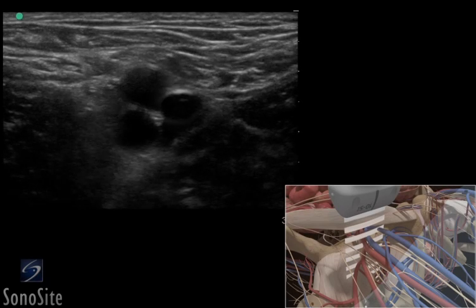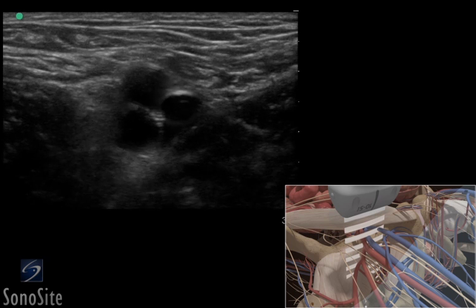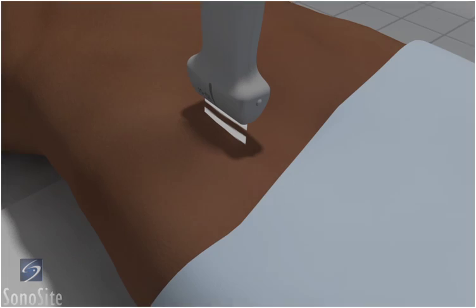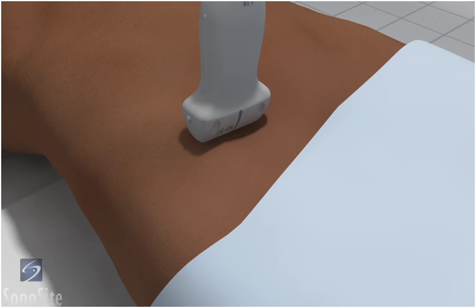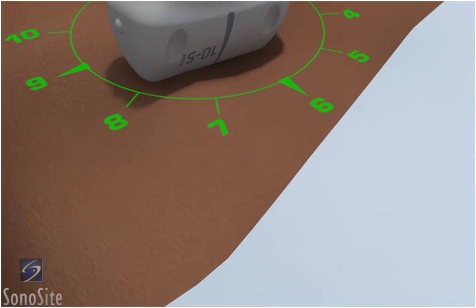A linear array transducer with a venous exam type is used to perform an ultrasound-guided insertion of a femoral vein catheter via a transverse approach. The patient is in a supine position with the operator at the right side. The transducer is placed transversely just inferior to the inguinal crease with the orientation marker directed to the patient's right at a 9 o'clock position.